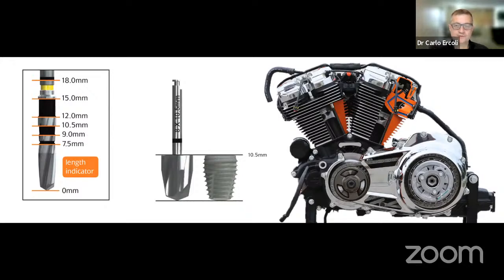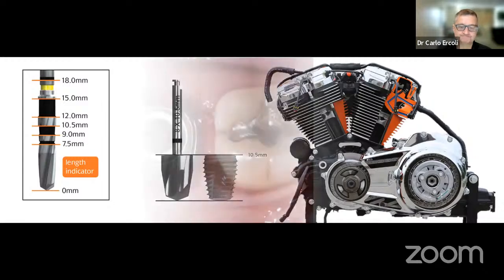Now, you might wonder what that Harley Davidson engine does, what is the meaning of that engine? The reason why I brought it there is just to bring a little humor, because one day when I was doing one of the surgeries with this large implant in a colleague of mine, this large drill produced a fair amount of vibration, a fair amount of chatter. And I was feeling kind of guilty. So I was apologizing to my patient, and his answer was, it is no different than riding my Harley, because I guess there are similar types of vibration. So that's the reason why I put the engine there.